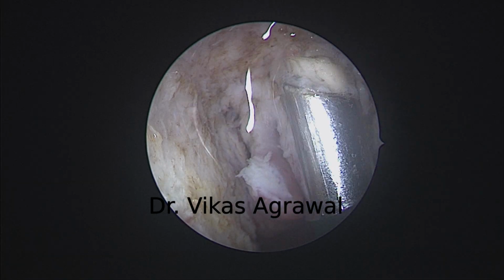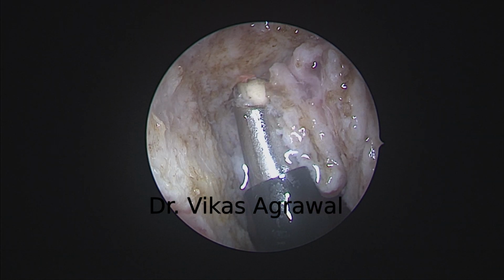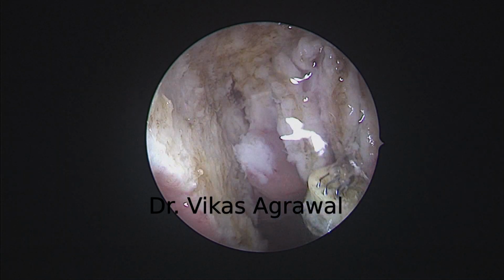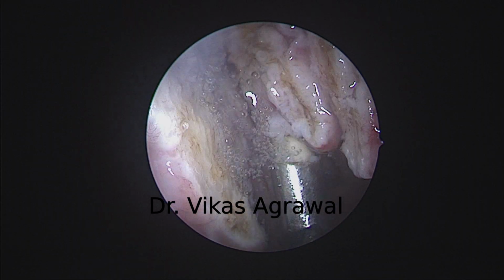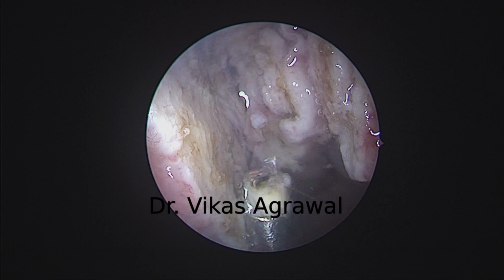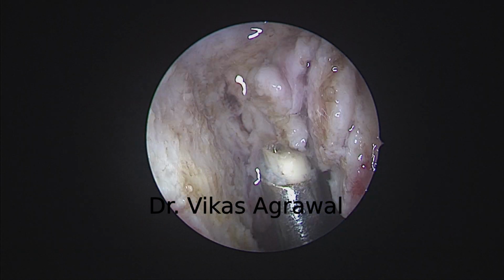This is the depth. Let me debulk the adenoids to reach the posterior boundary, which is the buccopharyngeal fascia, which I'll reach in a moment.